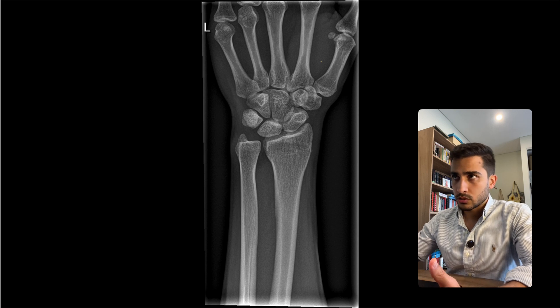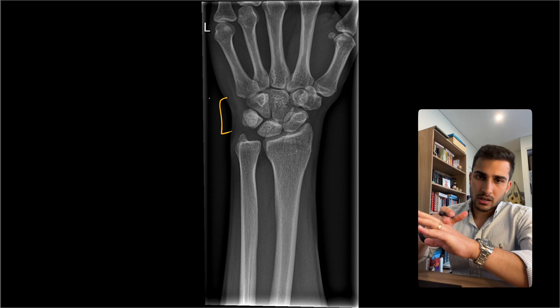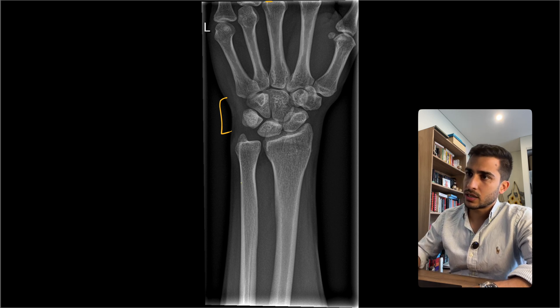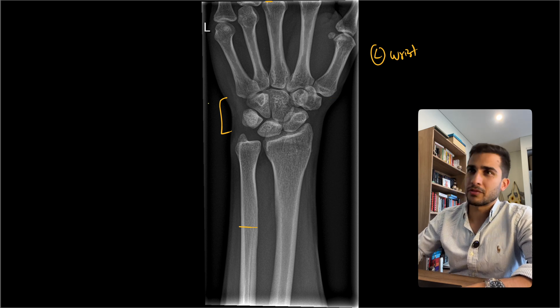So when we look at a wrist, what are we meant to include? Ideally, we have the carpal bones right in the center, and we include up until the knuckle and about a third of the radius. In this case, it looks like we're looking at a left wrist of an adult, so let's go through the critique and see what we find.